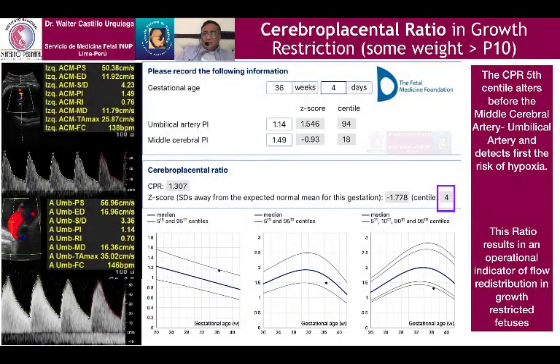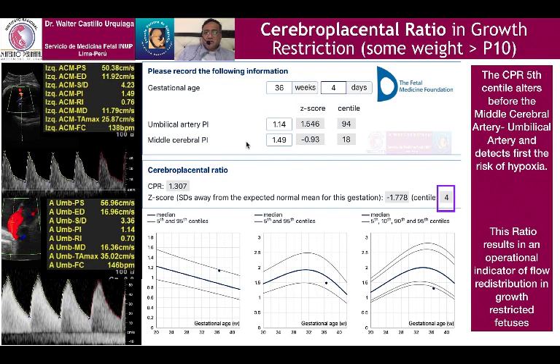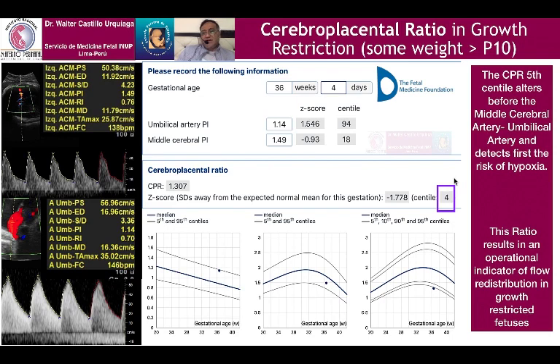In cases of growth restriction like this, 36 weeks and 4 days, we have these values: umbilical artery 1.14, normal centile, and middle cerebral artery 1.49, normal pulsatility index, normal centile. But the relation, cerebral placental ratio 1.30 is abnormal, lesser than the 5th centile — 4th centile.